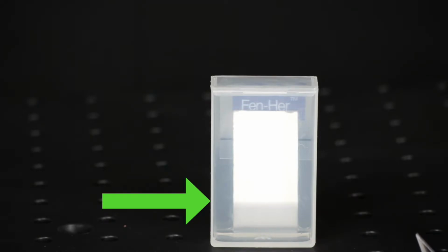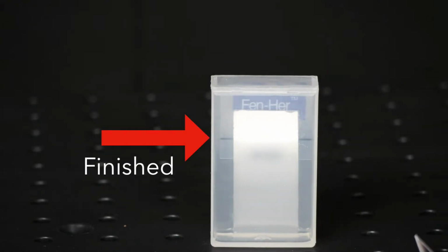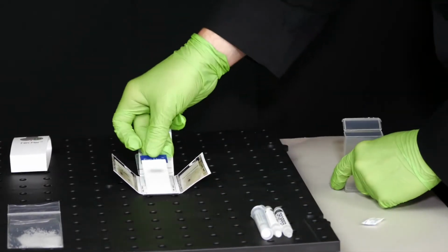Allow the liquid to wick up the plate until it reaches the black line, which takes 4 to 5 minutes. Be sure not to let the liquid wick beyond this point to avoid ambiguity in the results. Then open the chamber and remove the plate. Close the chamber once the plate is removed.